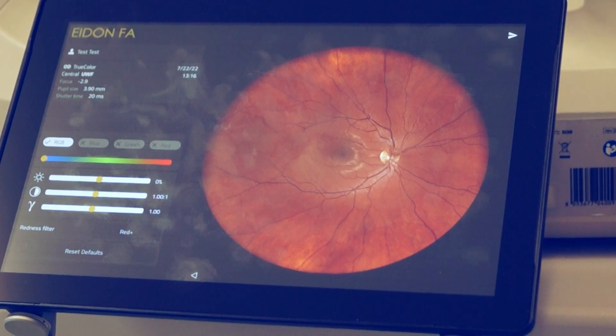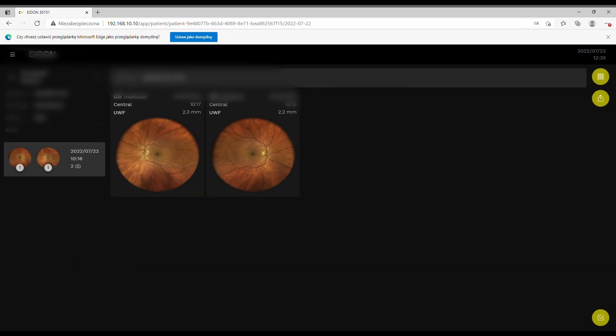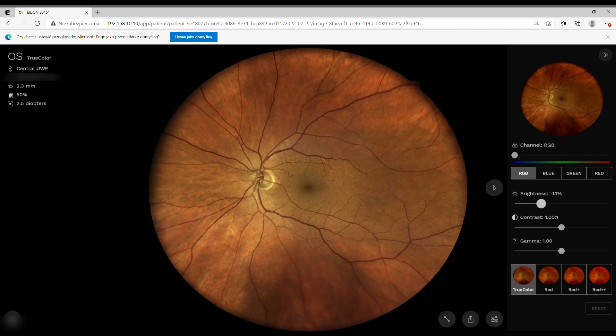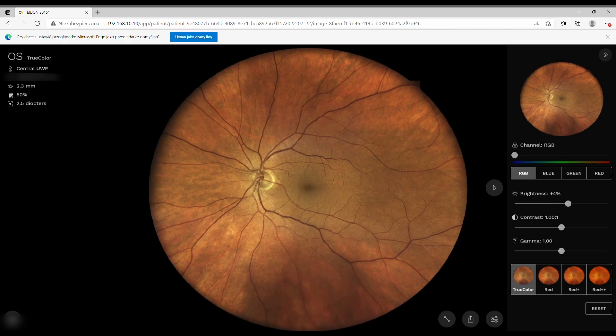If you connect the device to the PC, this is what you get — the viewer. You see small icons with patient name and ID, date of examination, and number of photos. There is no way to search other than by name and ID. When you click on a patient, you can change brightness, contrast, gamma, and use different filters like RGB, blue, green, red, and digital filters like TrueColor Red, Red Plus, and Red Plus Plus.